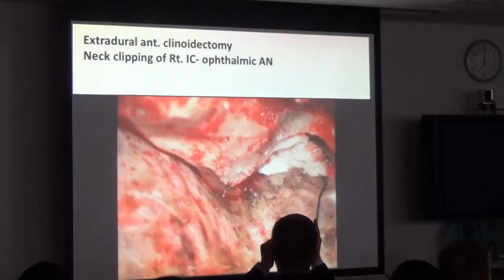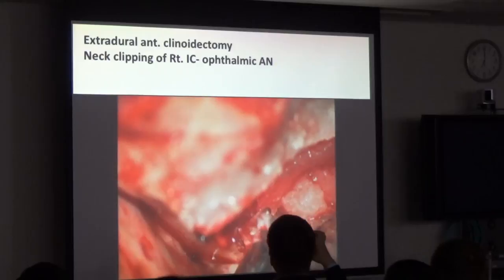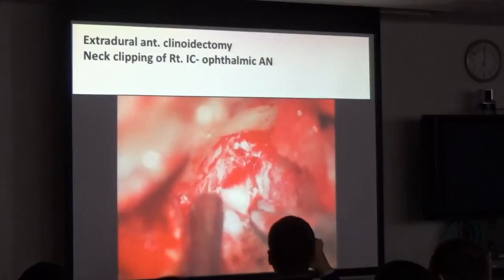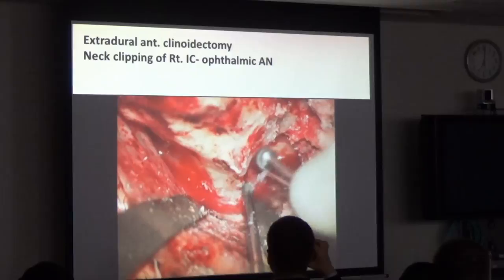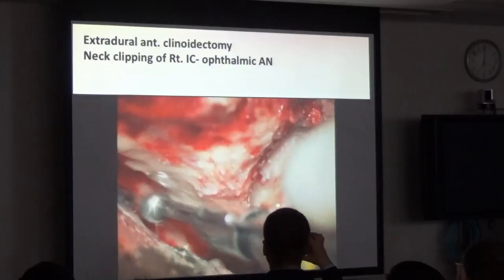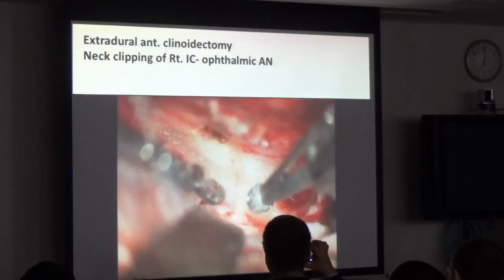And also from temporal craniotomy performed. And as I showed you, the periosteal dura was incised, so as to expose the lateral surface of the cavernous sinus, as you can see here. To avoid heat injury to the optic nerve, meticulous and continuous suction irrigation to the optic nerve is mandatory. Always irrigation, cooling down the optic nerve, very important.